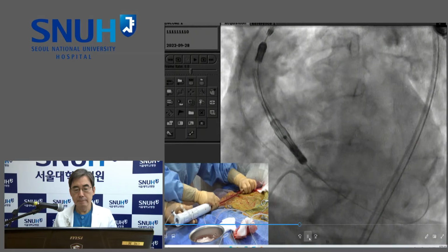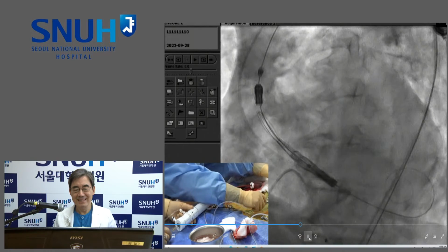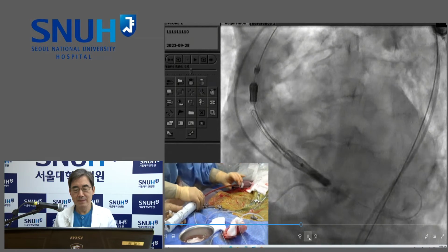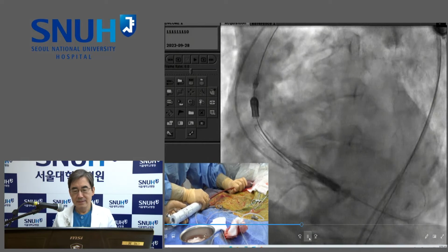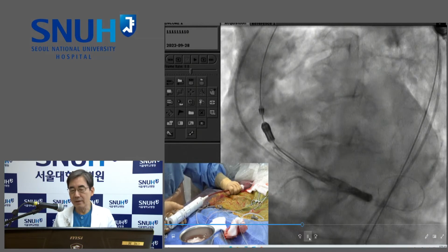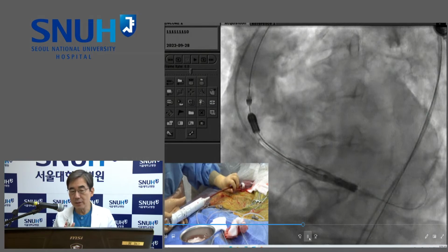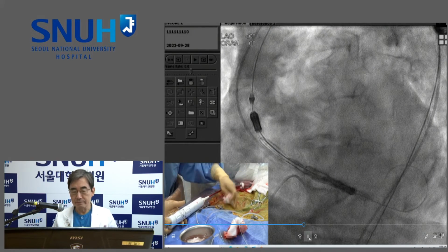I mean, there isn't a lot of metal up there, though. The cells are extraordinarily open above the valve itself. So, is that really a big issue, or is that just for perfection? If the coronary height is very low and sinus is not wide, in that situation, we are concerned about rotation. But in other cases, no problem. Yeah. No problem. Thank you.